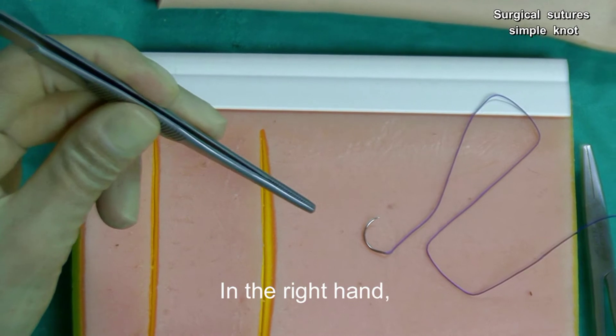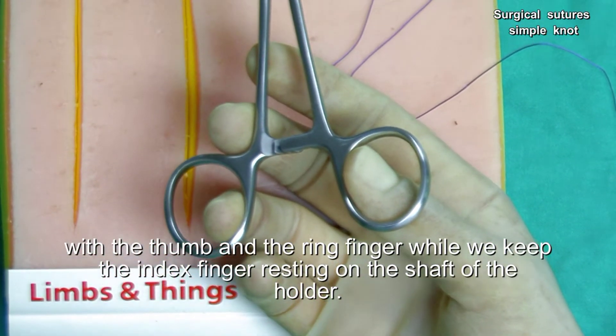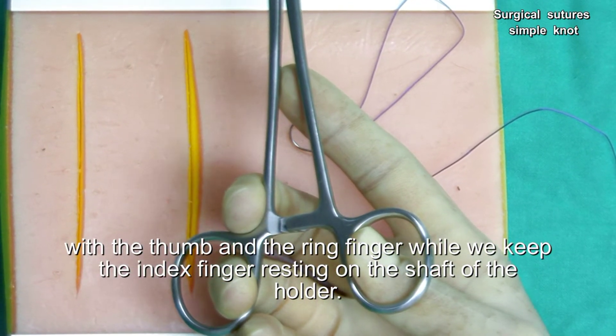In the right hand, we hold the handle of the needle holder with the thumb and the ring finger while we keep the index finger resting on the shaft of the holder.